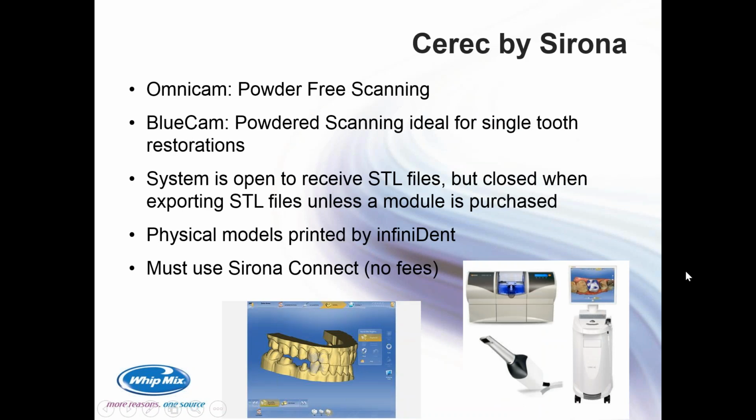Cerec by Sirona. They offer 2 types of scanners, the OmniCam and the BlueCam. The BlueCam is the other powdered scanner that's out there. This is more meant, sold with the in-lab. It's more meant for single tooth restorations. And then, we all understand the open system as far as Sirona, and they're open right now as far as receiving files. So they can now accept an STL file, but the files they export are still proprietary and can only be opened by a Sirona system.